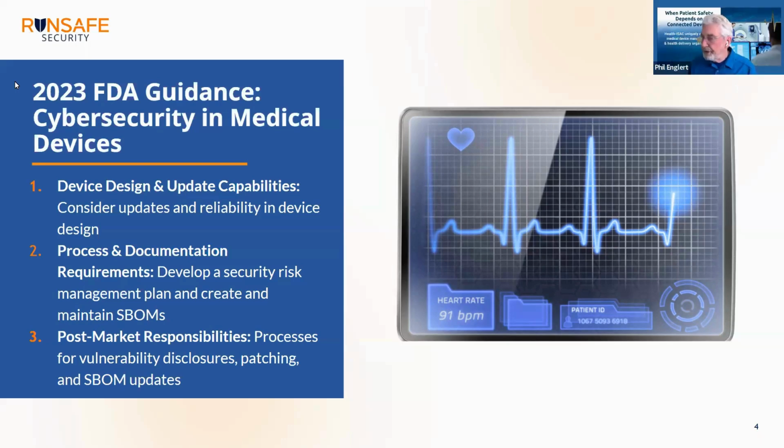So in considering the secure development lifecycle, knowing what vulnerabilities are associated with the component selection early on in the development process can certainly help organizations assess those risks, do those threat assessments, and even put compensating controls in or choose other components that may have fewer vulnerabilities and a longer life cycle to go with.